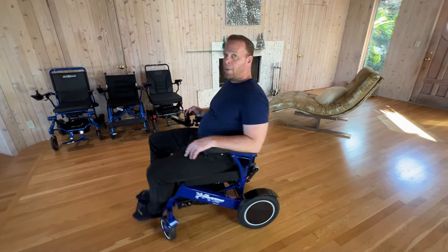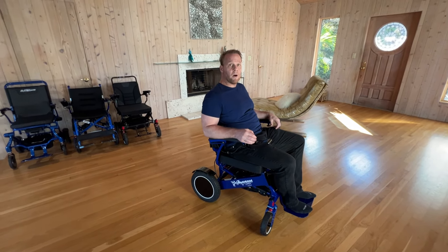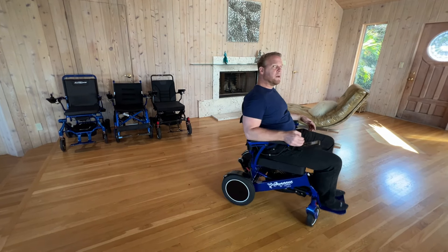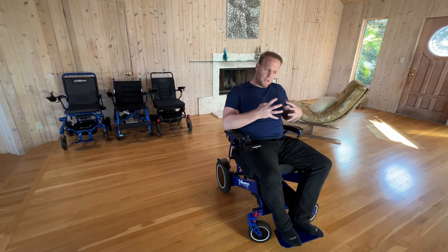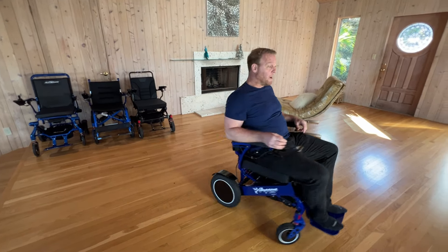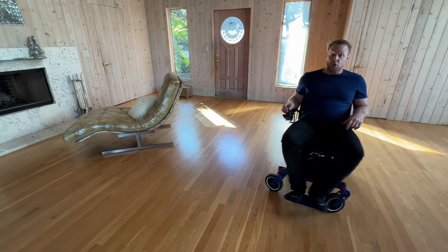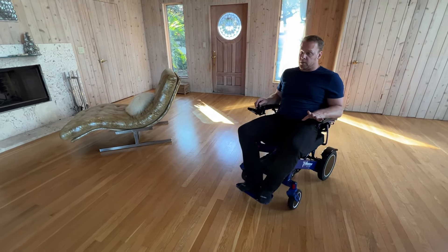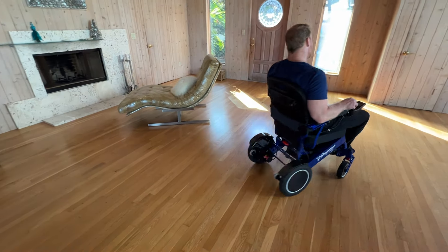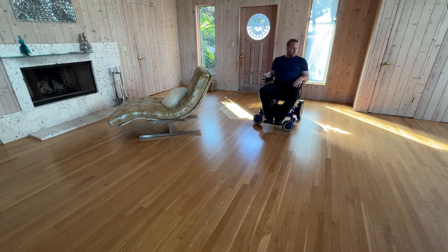First thing is, how well does the chair recircle? Oh my gosh — this chair, it feels like a luxury car compared to some of the other chairs. It is absolutely wonderful, just feels like a big cloud that you're floating along on. Much different than some of the other chairs — this is quickly becoming one of my favorites. I can get up to speed pretty quickly, and I am shocked at how well this grips the floor and turns around. It doesn't really slip, doesn't really slide — makes it very easy to maneuver on a slippery floor.